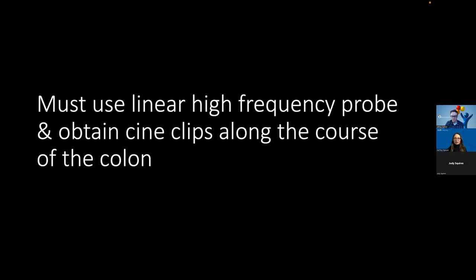To end, you must use a linear high-frequency probe and obtain cine clips along the course of the colon.